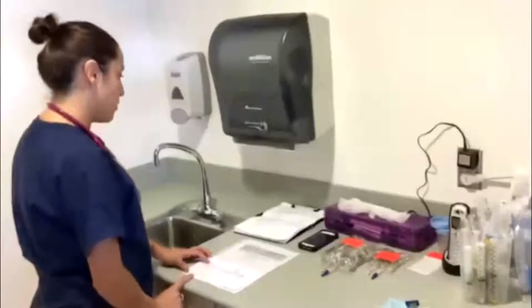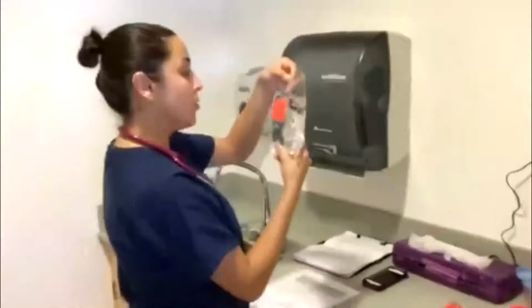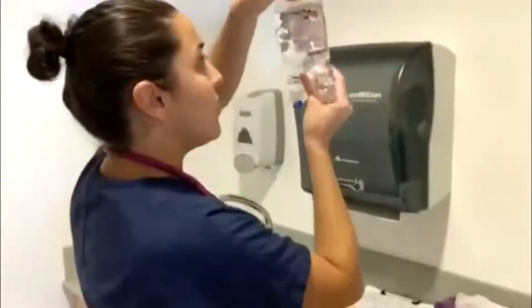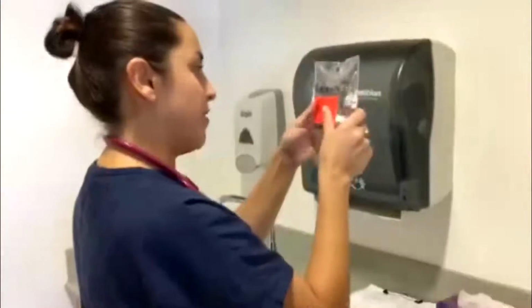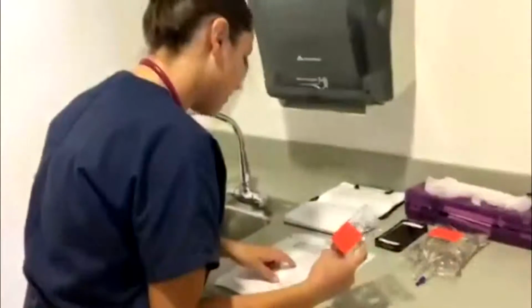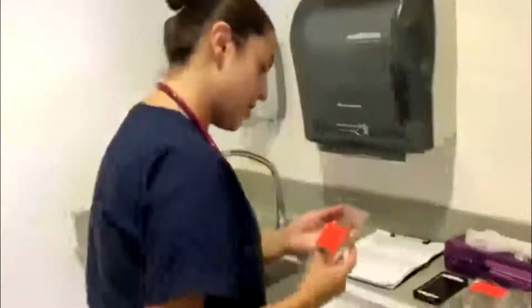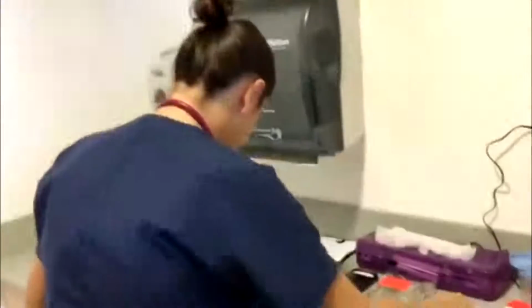So right now, I'm going to go ahead and withdraw the meds, which I have already. Right here I have my normal saline 0.9% sodium chloride. So I'm going to make sure to look at the clarity, see if there's any precipitate, and also if there are any leaks, which there are not. And I just want to make sure that I have the correct medication against the MAR, 0.9% sodium chloride. Right, and my second is the Zosyn, 3.375 grams in 100 milliliters. So I have my 100 milliliter bag of Zosyn labeled. Also checking for precipitate or any leaks, which there are not, so that's great.